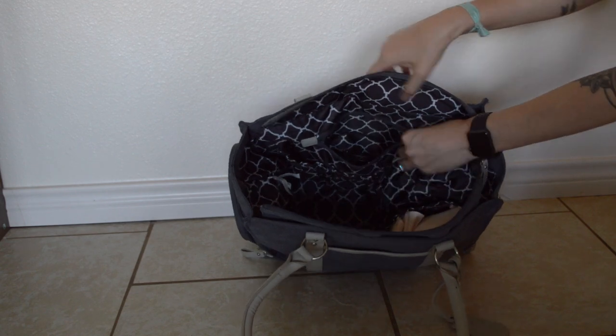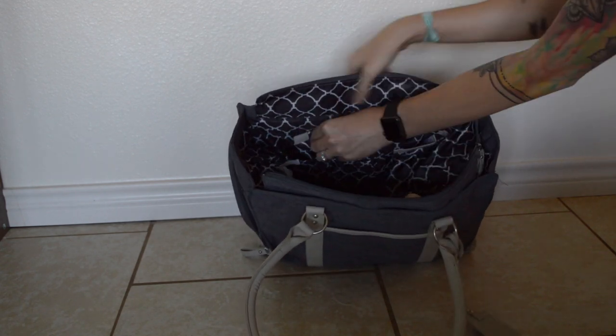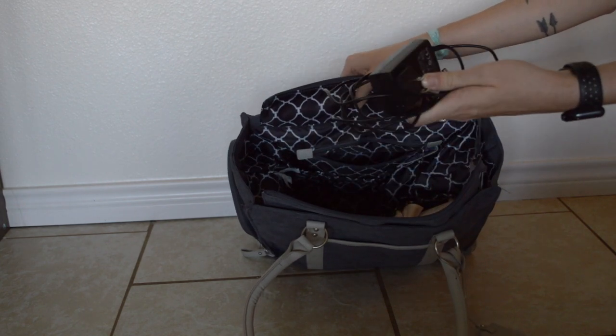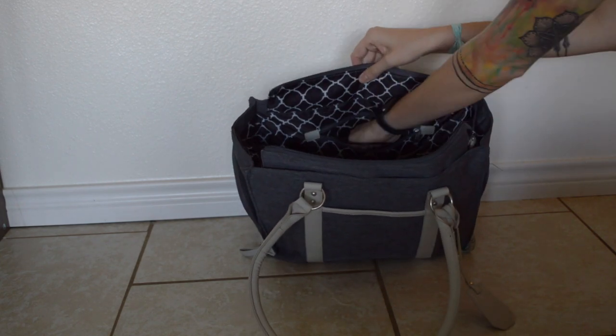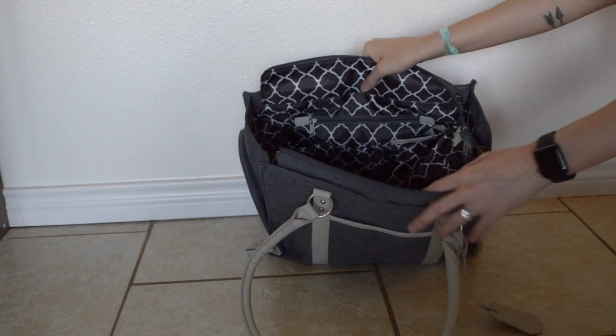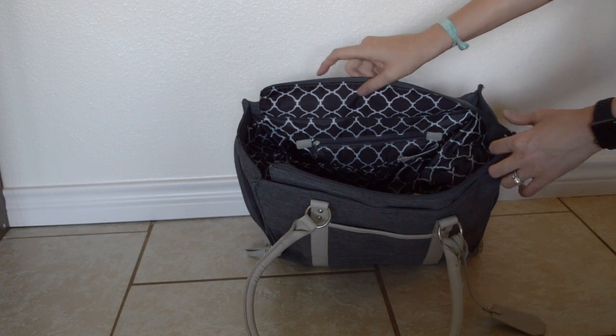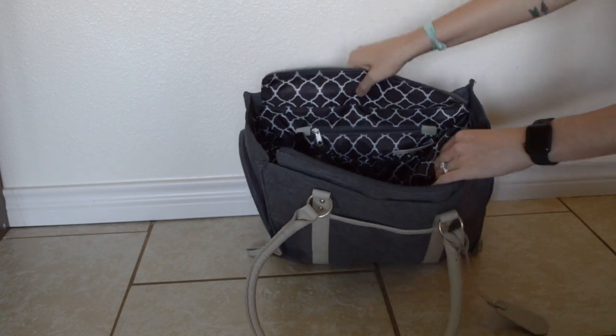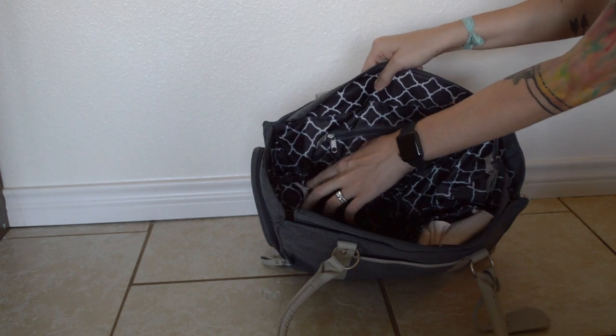On the back there's a zipper pocket where I keep the AC adapter for the pump, just for easy access. The pump battery lasts a really long time so I hardly ever use it unless I'm at home, but I like to have it just in case.